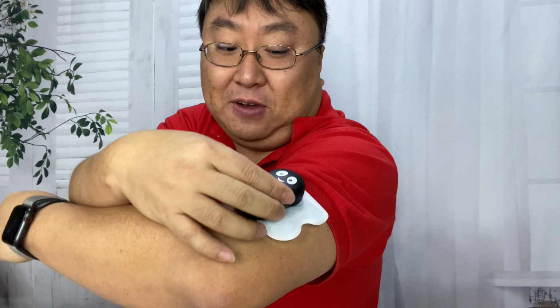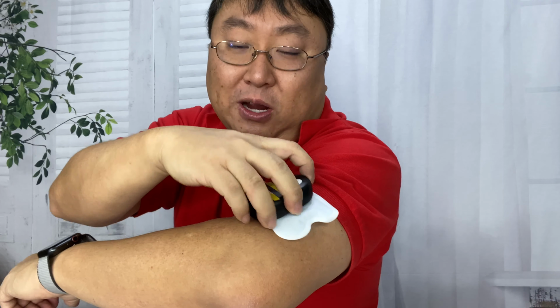And then you turn it on, and you have actually 2 factors going into making this area a little less sensitive. You've got the bee on there, and then you also have the cooling gel. So you're kind of numbing it up and then also vibrating it to create numbness.